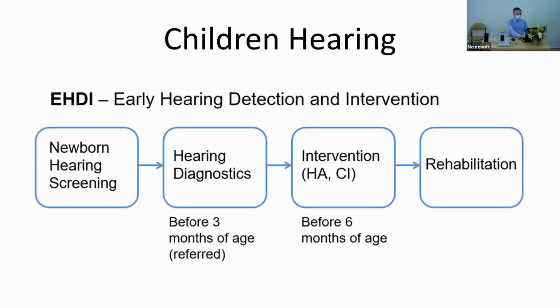But first, I would like to briefly cover the topic of newborn hearing screening, because since we want to describe otoacoustic emission tests today, it is very tightly coupled with this topic, with the screening.